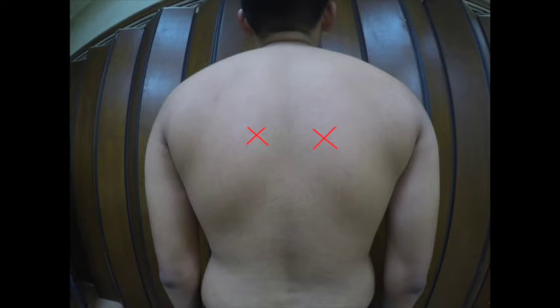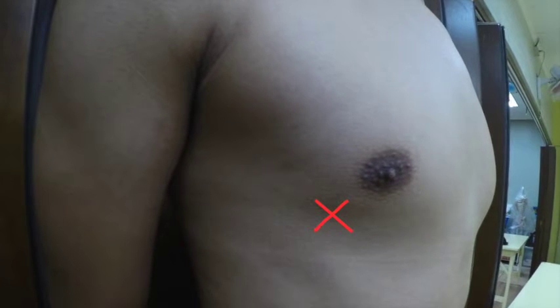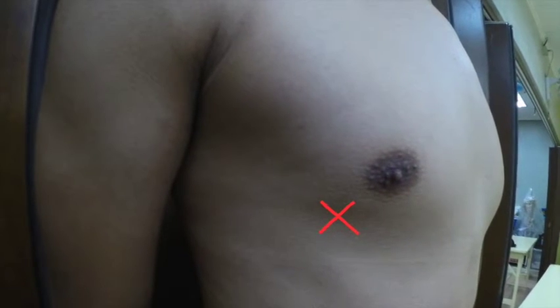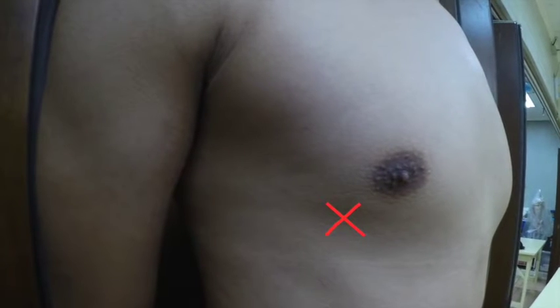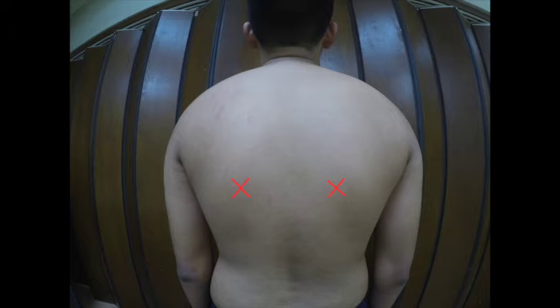For the superior segment of the lower lobe of both right and left lung, place the stethoscope medial to the scapula, between the root of the scapular spine and the inferior angle of the scapula. For the anterior segment of the lower lobe of both right and left lung, place the stethoscope immediately lateral and below the nipples. For the posterior segment of the same lobe of both right and left lung, immediately place it medial and inferior to the inferior angles.